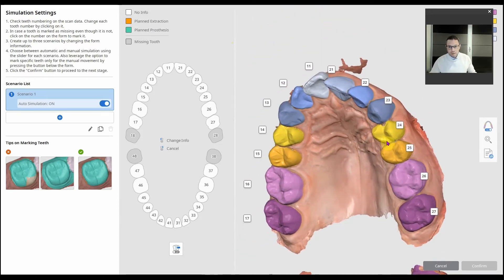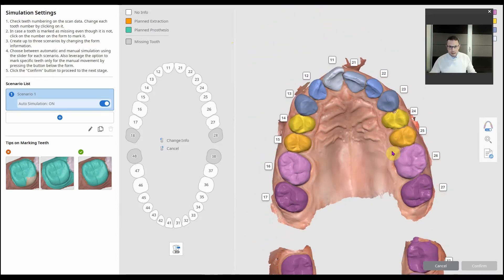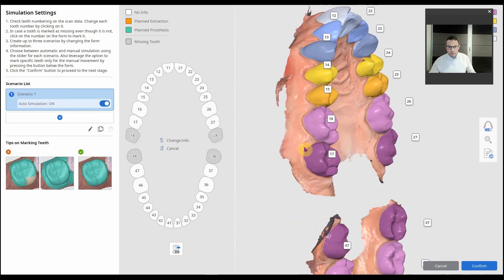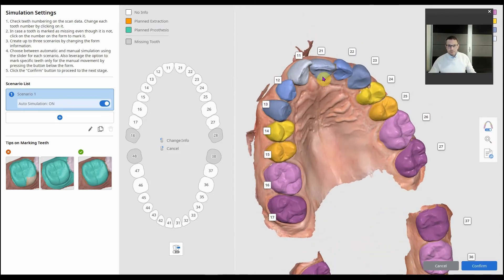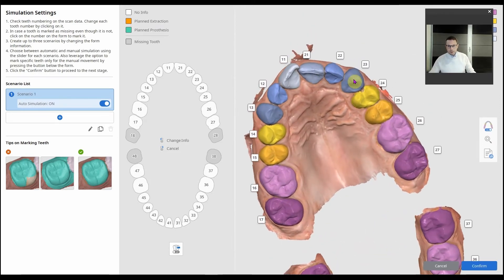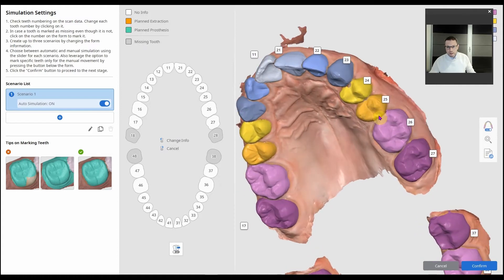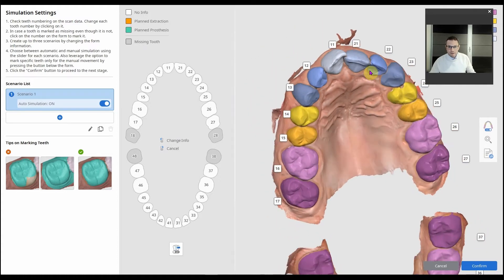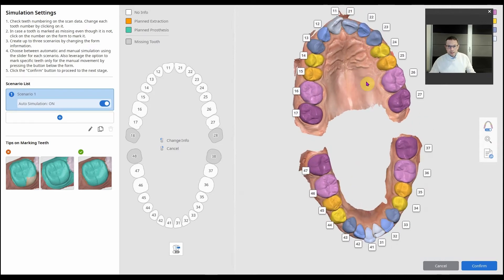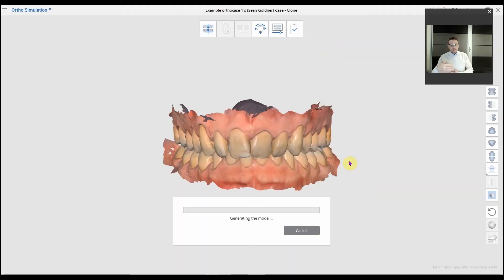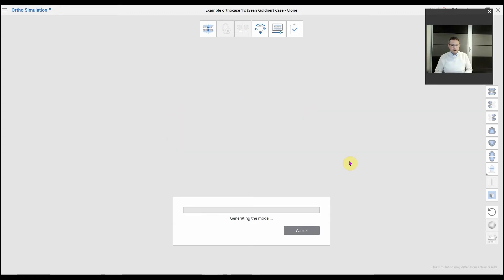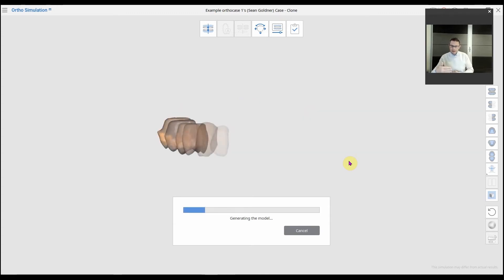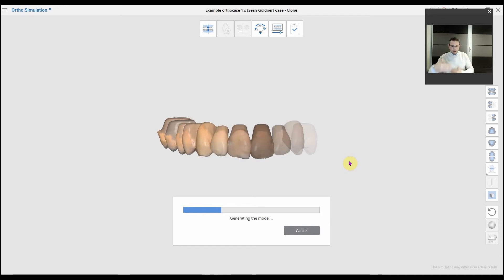It uses the automatic margin line creation tool to segment all of the teeth. It automatically recognizes from the position, shape, and morphology of the teeth the tooth number, and it makes a separate 3D model of all of the teeth. It does this automatically, calculating a base and creating one as well.